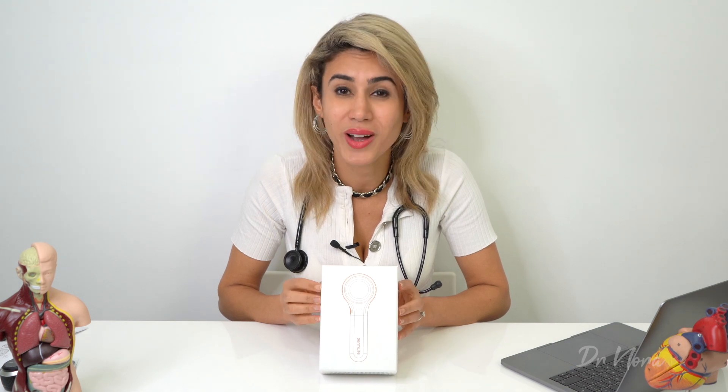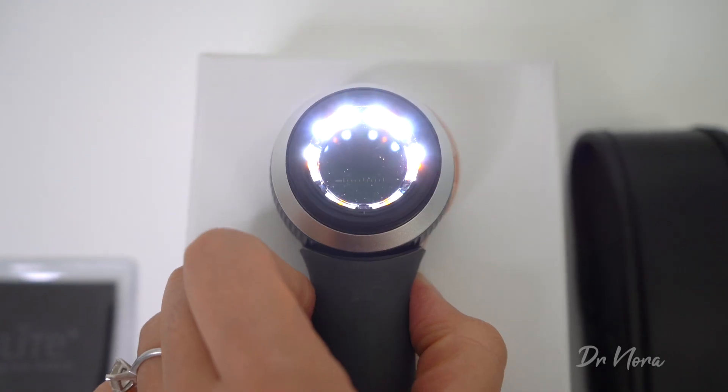With alarming figures of one out of two Australians developing skin cancer at some point in their lives, it's vital that as a general practitioner I'm able to identify and diagnose these lesions. To do this I use something called a dermoscope or a dermatoscope, depending on where you are in the world. This is essentially a piece of equipment that has a magnifying glass and a light attached on the end that allows for detailed analysis of the skin.